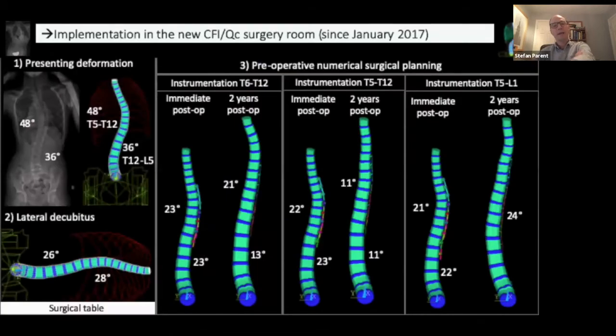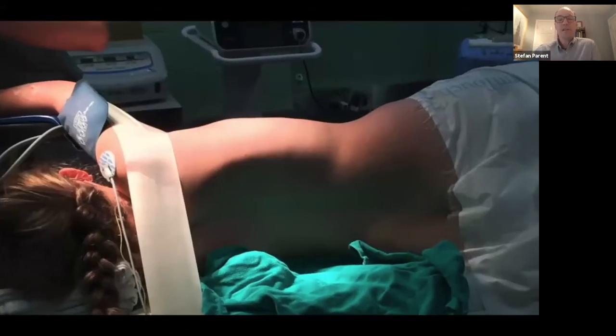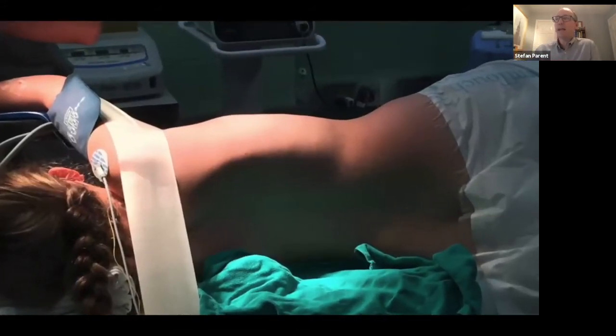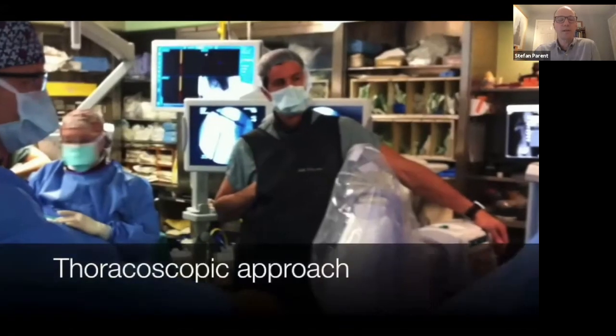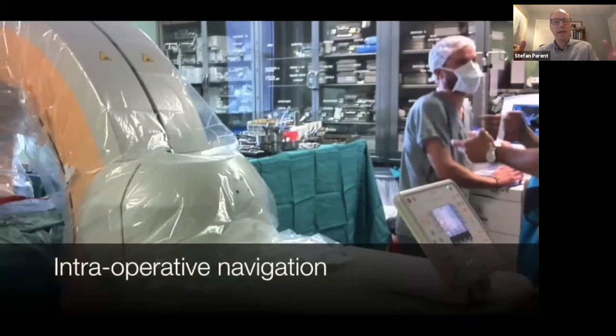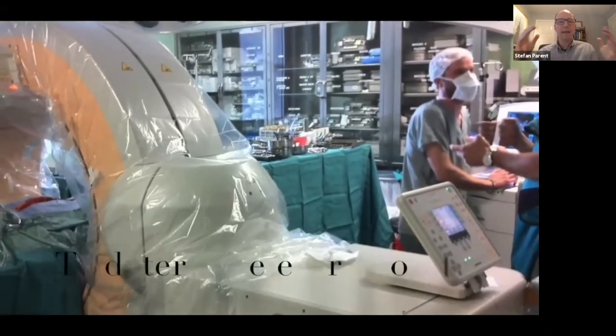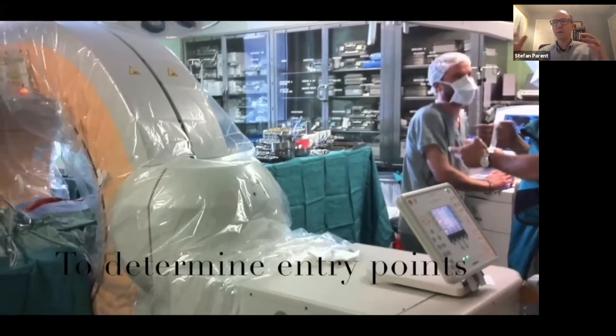For a long time, we did simulation for all our curves. I don't do this on a regular basis anymore, but it's something that we still use. Positioning is essential. And I use navigation to find my entry points. It's a thoracoscopic approach, so you want to make sure that you're well located. So I use intraoperative navigation to locate my entry points, not necessarily to put in my screws. I know some people do this, but I don't necessarily do this.